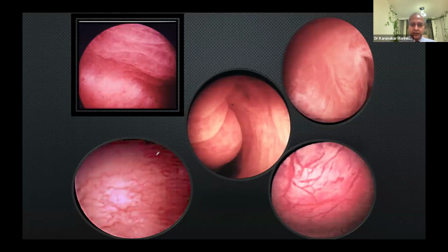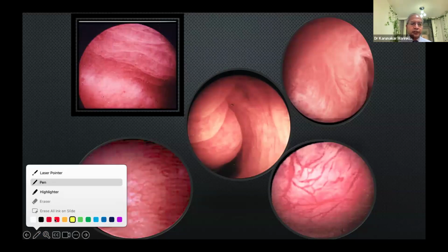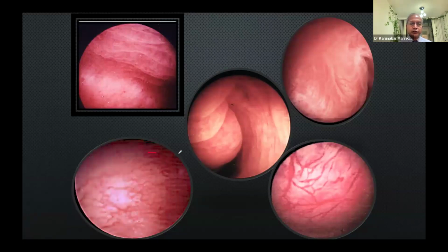If you can see the blood vessels here, they're all horizontal. Each blood vessel here is going horizontal to the endometrial plane. Normal endometrium in the luteal phase, you'll never see blood vessels. You will see the end-on view, but again, it is so distant. You can't even make it bleed by poking with an embryo transfer catheter or even the tip of the hysteroscope. You can puncture the endometrium in the luteal phase, still there is no bleeding.